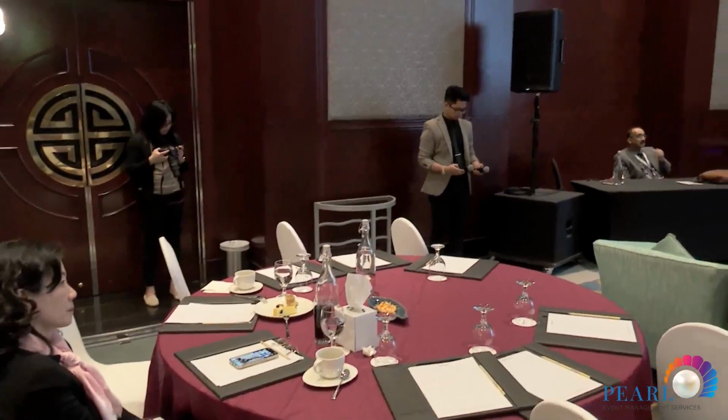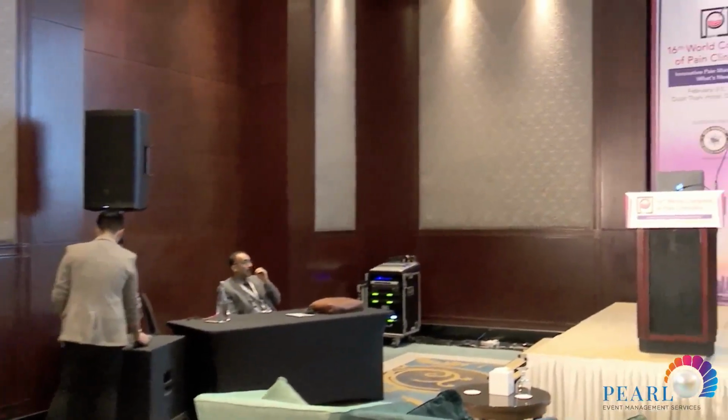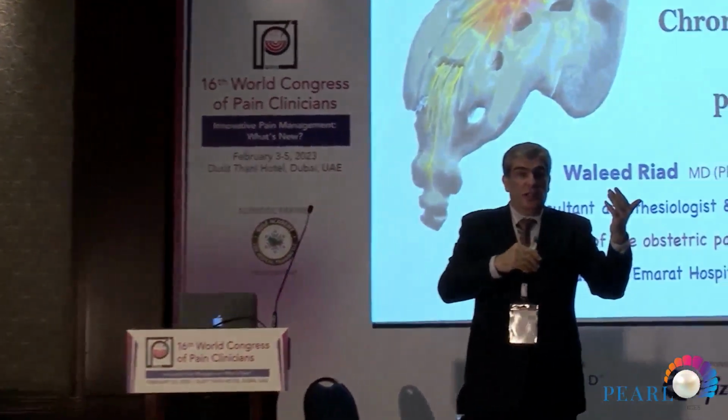Hardware. Yeah. Whenever you have hardware, the foramen will not be visualized adequately. Whenever I used to do the fluoro technique with the hardware, I used to just compare both sides to estimate where the foramen is and to go by a paramedian approach. This is the paramedian approach. This is not like doing an oblique and going inside the foramen. This is exactly a paramedian approach.